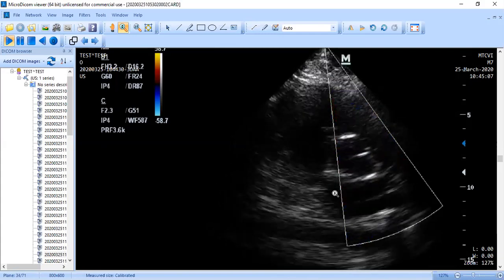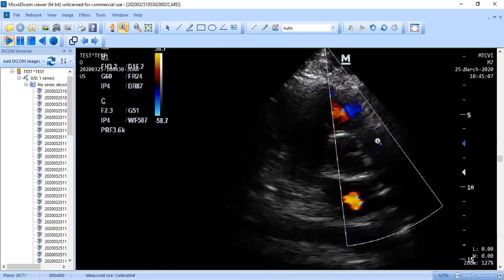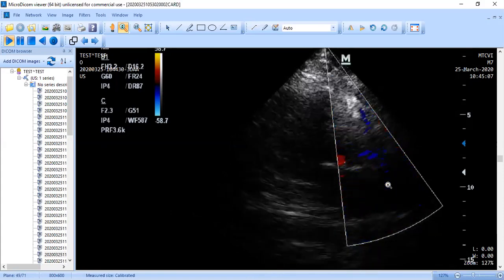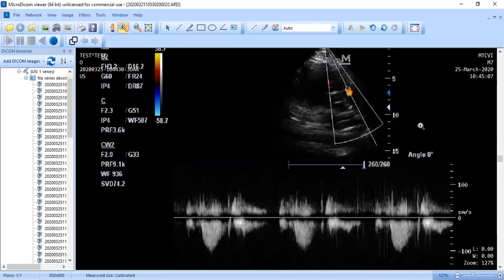So here is the pulmonic valve. So in this view, again, like I've said in the past, a lot of times it's tough to see these valve leaflets for the pulmonic valve. It's okay if you don't see them all that great, but we do put color on there. We see nice color flow going through there, and that's really what we want to see, okay? So now we're also going to put continuous wave through this valve here again, but because we did these measurements already in our RV outflow view, we're not going to measure it again, but we're just still going to show it. So we can just say that we did interrogate this valve in 2 views.